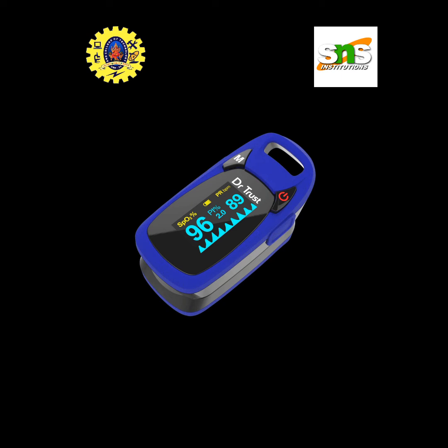Depending on the amount of oxyhemoglobin and deoxyhemoglobin present, the ratio of the amount of red light absorbed compared to the amount of infrared light absorbed changes. Using this ratio, the pulse oximeter can then work out the oxygen saturation.